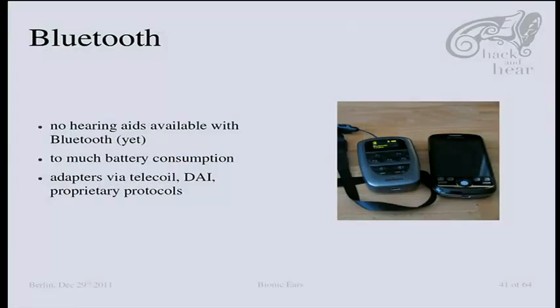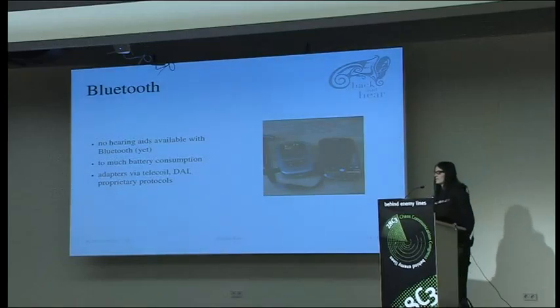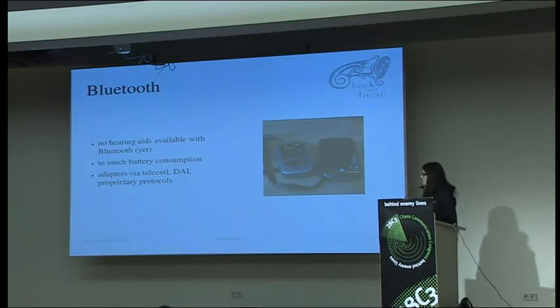And then there's Bluetooth. Right now there are no hearing aids that can do Bluetooth directly, mostly because of the batteries. Usually, hearing aid batteries last 1 week to 10 days, but with Bluetooth, I think they would only last a couple of hours. Although there are no Bluetooth enabled hearing aids on the market right now, I've heard that they are working on that. Siemens is located in Erlangen, which is not that far from Munich, so I have heard about people who test prototypes.